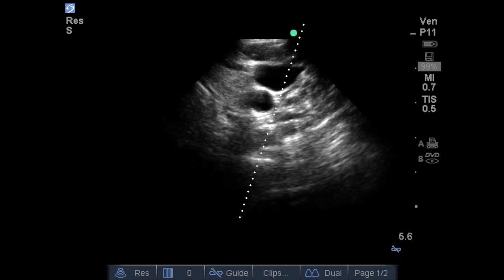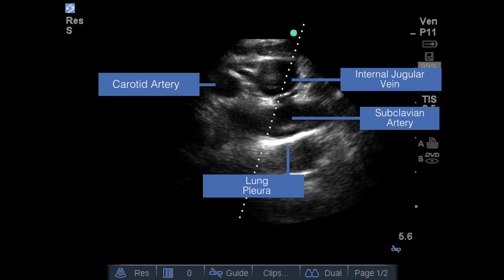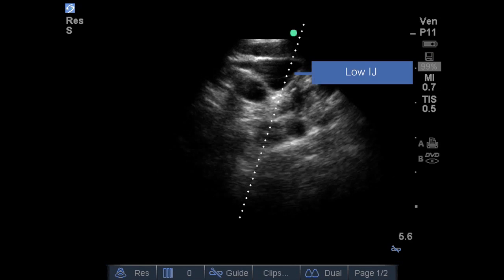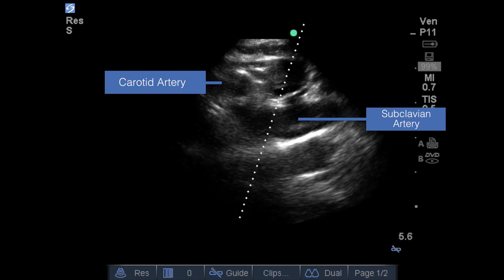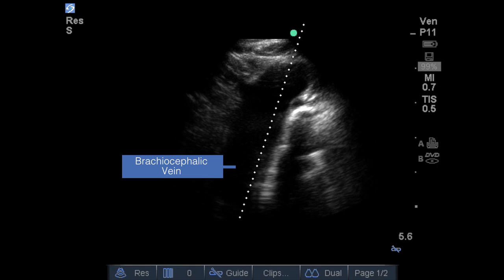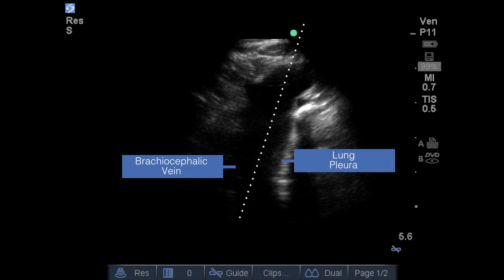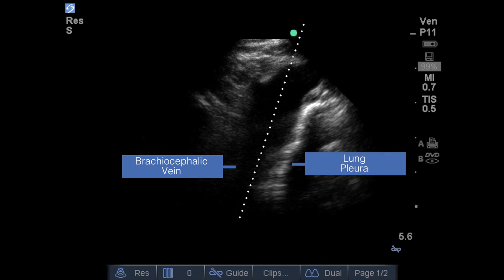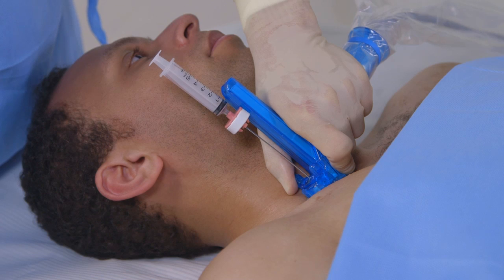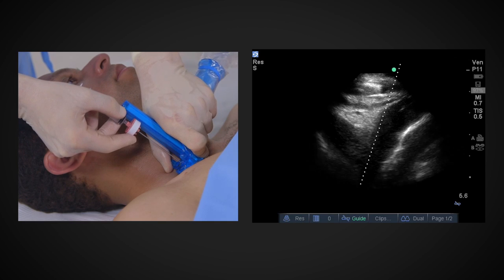Here's a look at the sonogram from an actual procedure. At the level of the clavicle, the internal jugular vein and the carotid artery are clearly identifiable. As the probe rotates toward the coronal plane, you can see the low IJ, the carotid artery, and the subclavian artery taking off from the brachiocephalic trunk. As the probe rotates further, the lung pleura defining the inferior border of the subclavian vein and the lateral border of the innominate vein appears as a distinct bright streak on the right side of the ultrasound image. With the on-screen target line parallel to the lung pleura, hold the needle assembly and syringe approximately as shown, noting that it may be necessary to tip the probe to align the target line with the innominate vein.